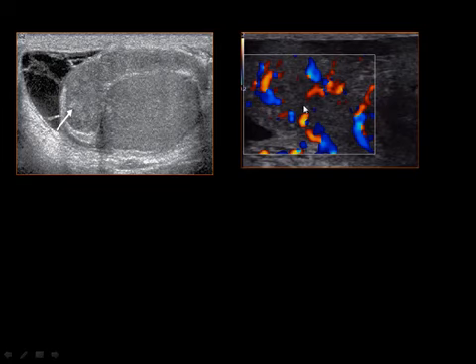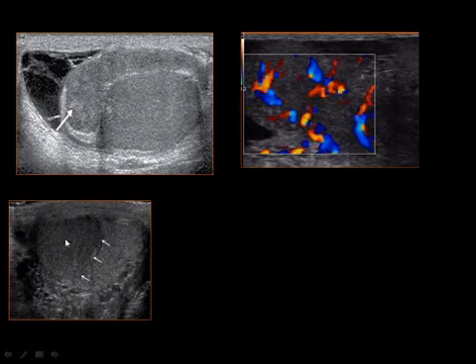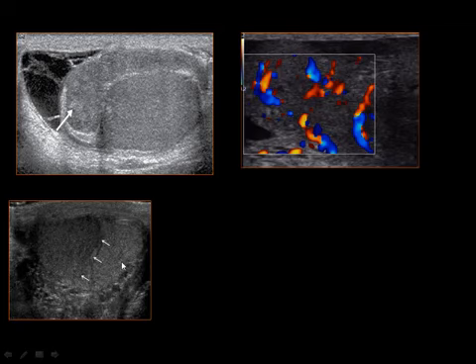This epididymis is enlarged with heterogeneous texture. Here is a complex hydrocele with many septations. Color Doppler shows hyperemic flow within the epididymis. This is an example of orchitis, a focal area of hypoechogenicity. It might look like infection or neoplasm.